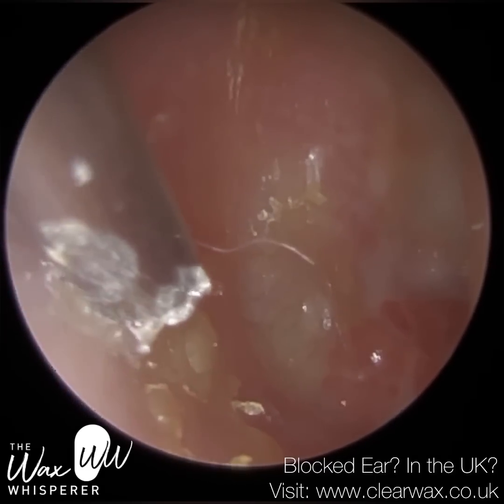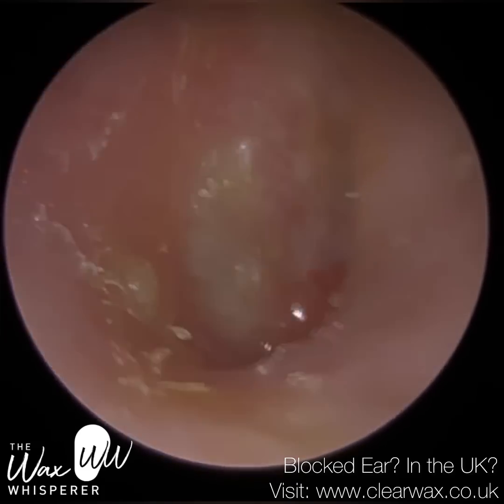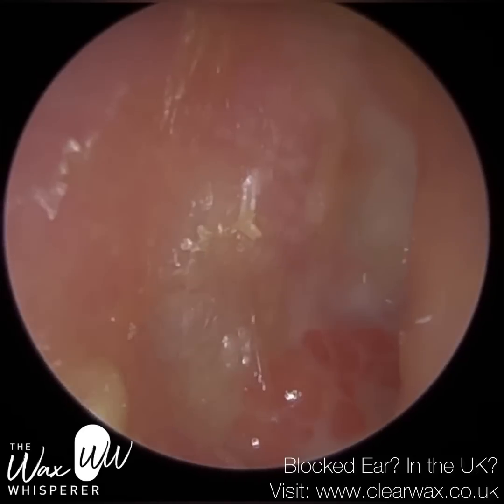And this is the posterior canal wall. So again, on the bony part, I'm angling the suction probe away, you can see, towards the eardrum. I don't want to angle the suction probe, if possible, towards that direction. I want to glide and go away.